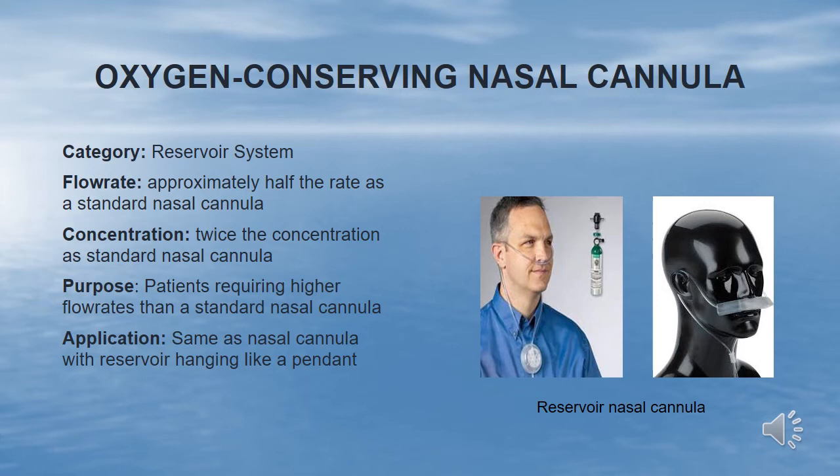It is used for patients on long-term oxygen therapy at home who require higher flow rates than a standard nasal cannula. The reservoir cannula fits the same as a standard cannula, but has a reservoir that fits below the nose or neck like a mustache or pendant.